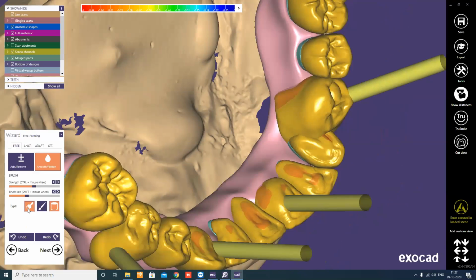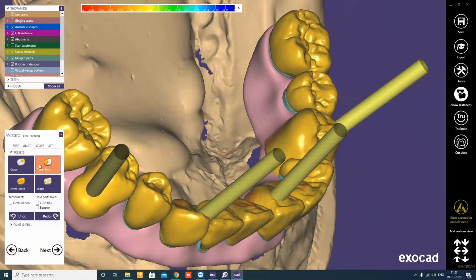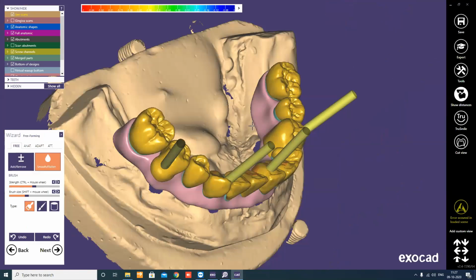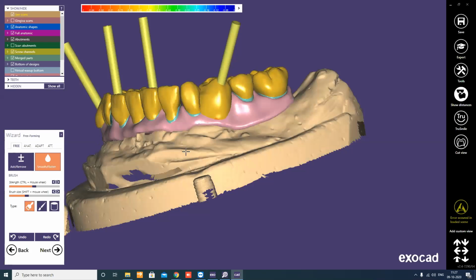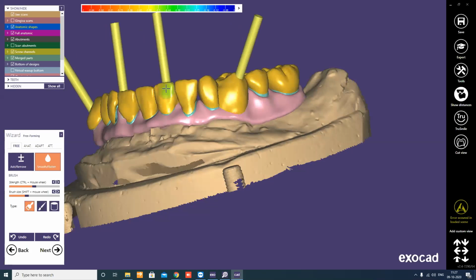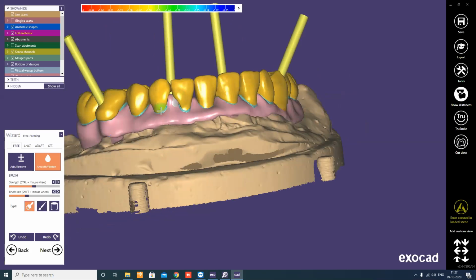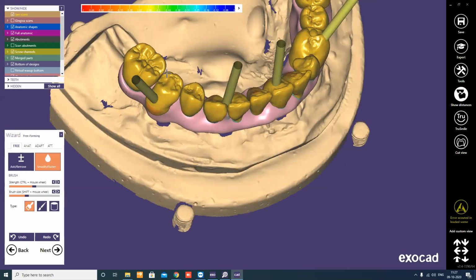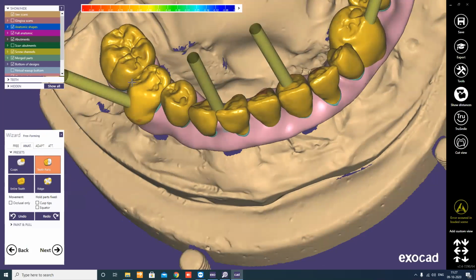And here we just, this is negative arch, and that is how. This you can just pull it out little bit and then make it look little better.